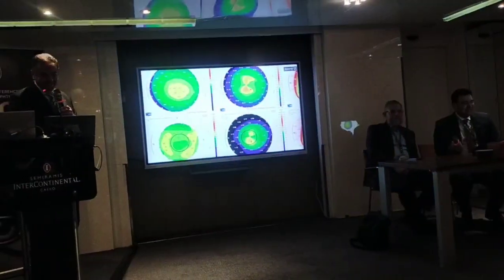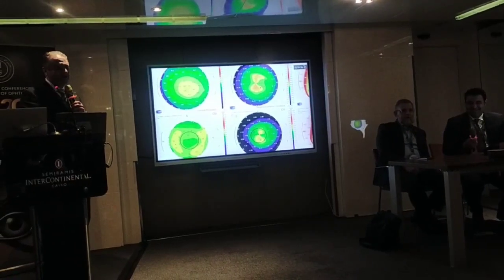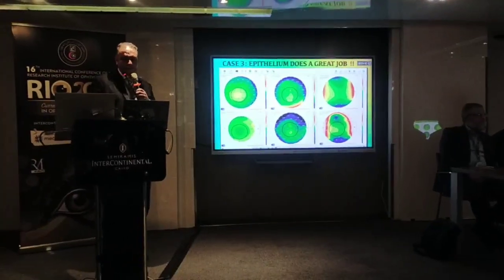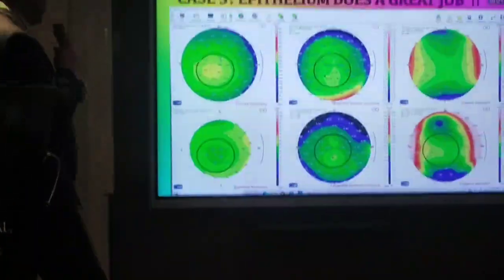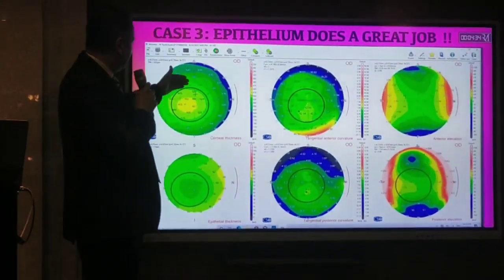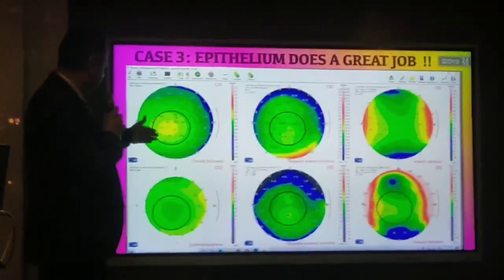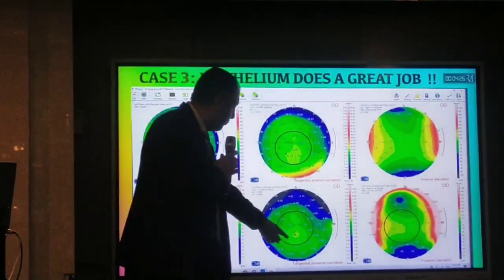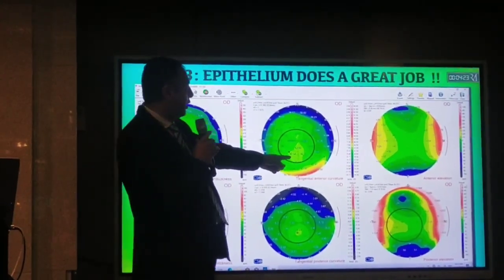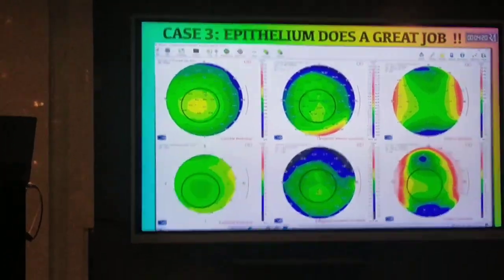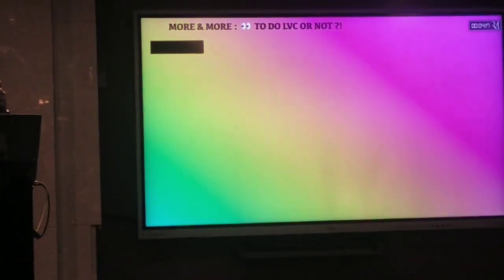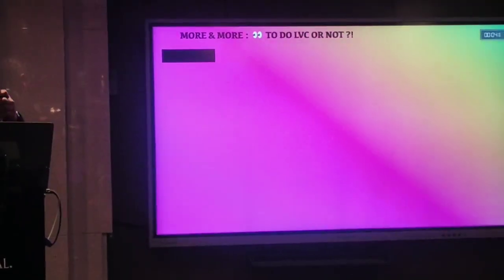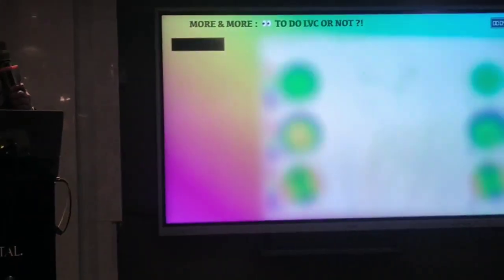Case three — epithelial mapping does a great job in this case. When I saw this case I found a diffuse, significant division with epithelial thinning, the posterior surface is steep, and the anterior surface is steep too. I felt suspicious for this patient and excluded them from refractive surgery.